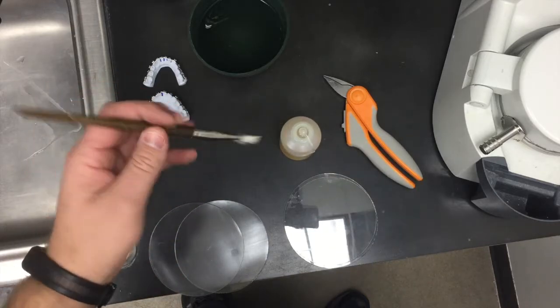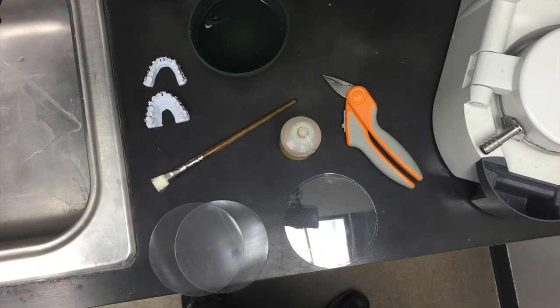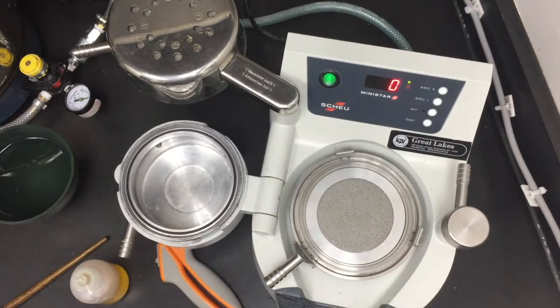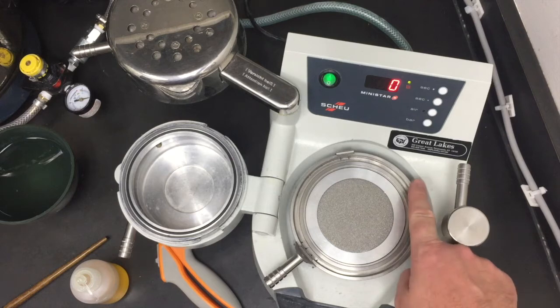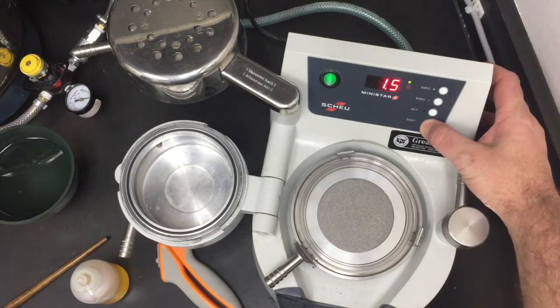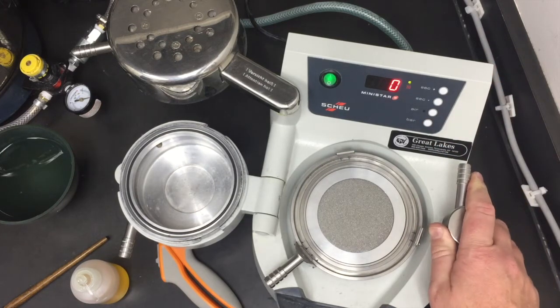You'll need a brush to apply that PAM oil. We also have our bowl of water where we'll actually soak the models to release the brackets from the model later on in the process. One last thing we'll need is the Mini Star from Great Lakes — you can see the Great Lakes label right here. This is a positive pressure machine where it actually pushes pressure down on top of the material instead of vacuuming it like the older style. You'll need to set your Mini Star to 1.5 bar — Great Lakes recommends 1.5.